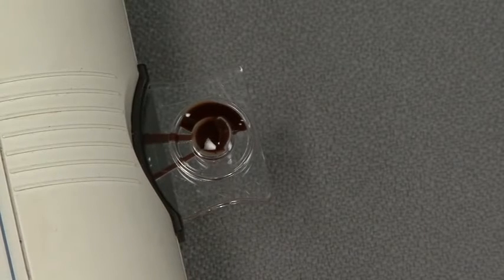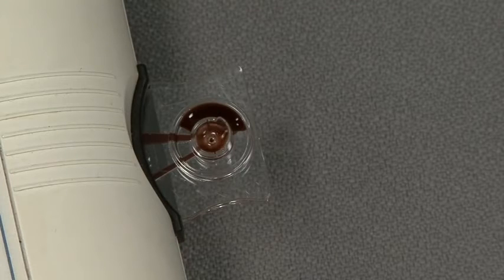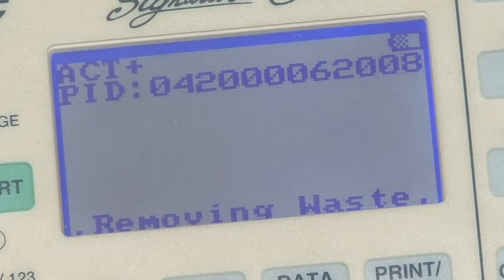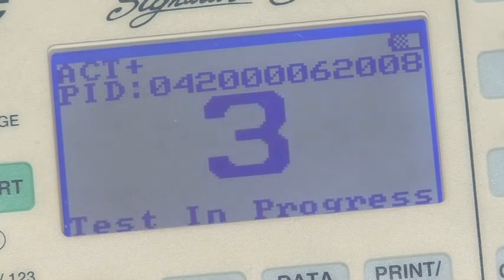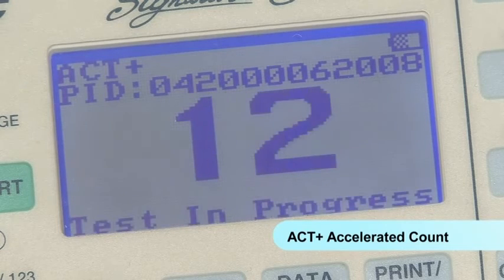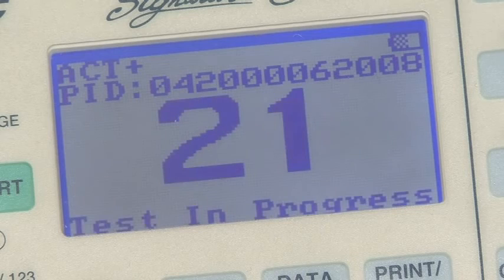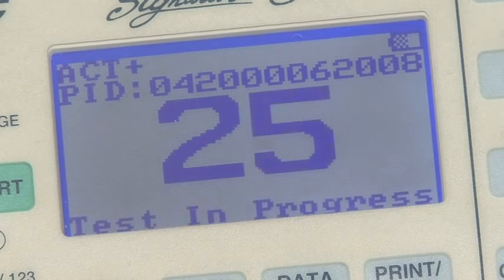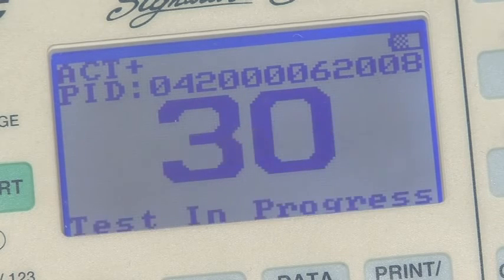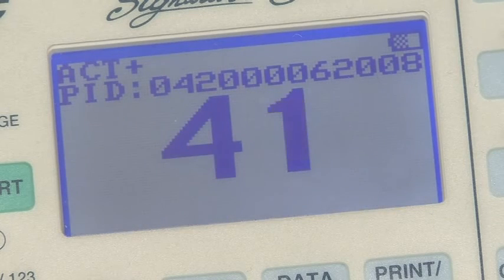Elite automatically draws the sample, and any excess, into the device. As the test begins, you'll see the count displayed on the screen. When running the ACT Plus test, only Hemocron Junior offers an accelerated count, reducing test time by as much as one-half. The result is that Hemocron Junior ACT Plus tests can be completed in 4 minutes or less, and the clinical team can move on to the next step of surgery more quickly.